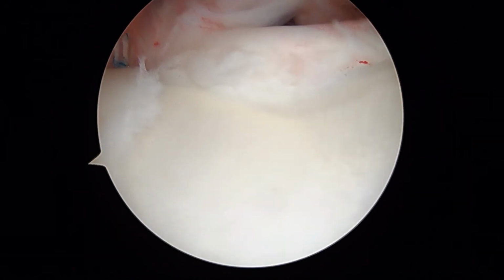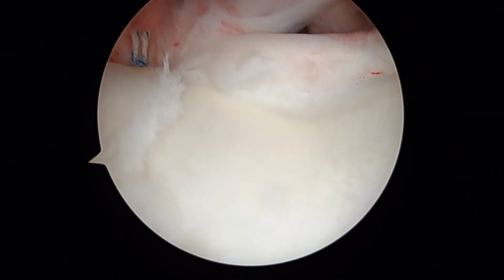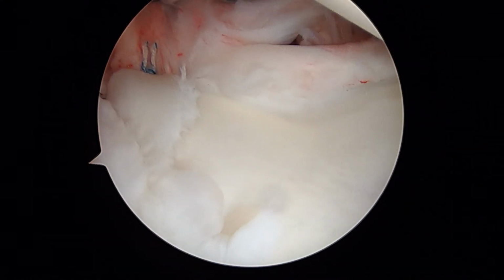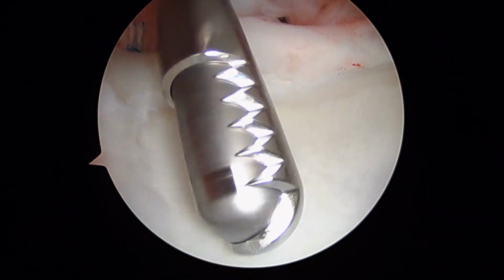I'm going to trim the inner edge just a little bit, and then we're going to go to the open tenodesis part of the case. So that'll be the end of the video. But right now we're just going to trim a little bit here.